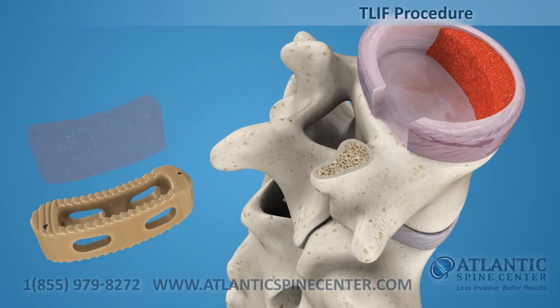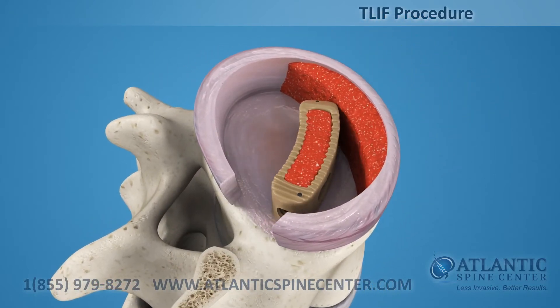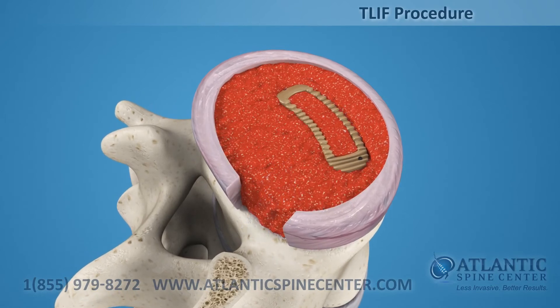After the disc is prepared, a biocompatible polymer implant is filled with bone graft material and placed in the disc space. Additional bone graft may be placed around the implant to increase the surface area for fusion.